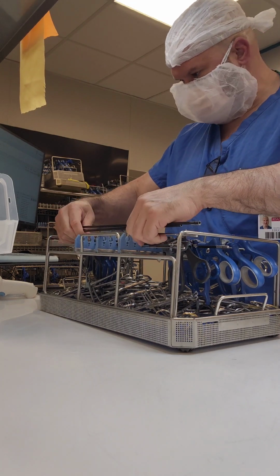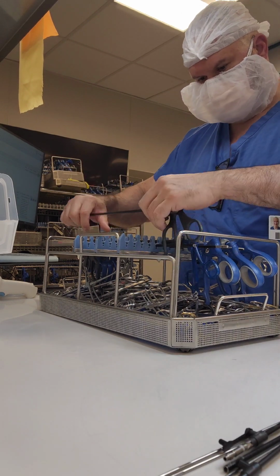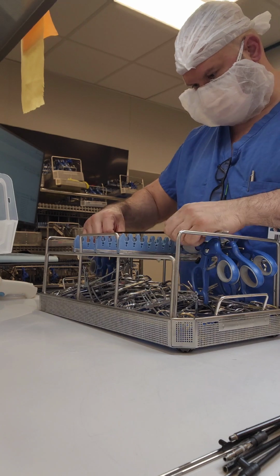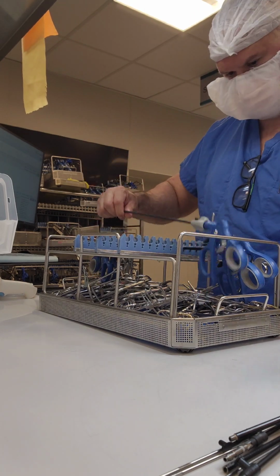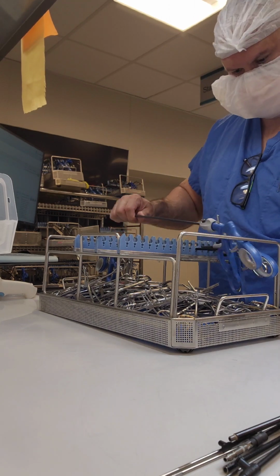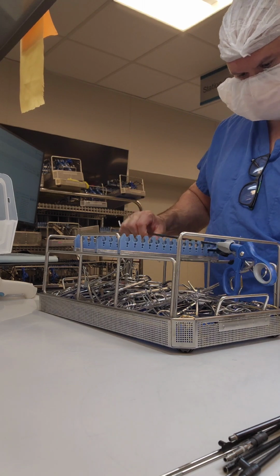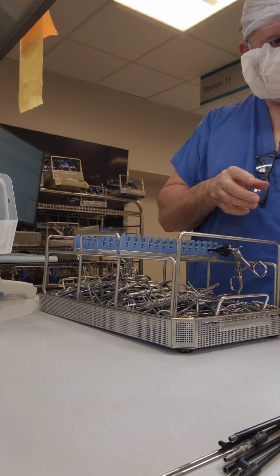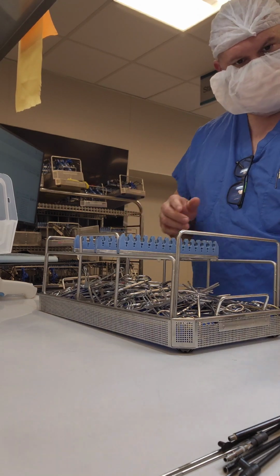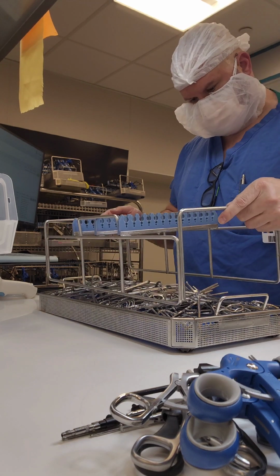All right, guys, if you've seen the fast forwarded video of me putting a lap tray together, here is the full 45 minutes it took me to assemble this tray. So first things first, guys, when you assemble a tray, I don't care what kind of tray it is, whether it's instruments, whether it has a holder, laps, whatever, you should remove all your instruments from its holding device, whether it's a tray or a rack as such.